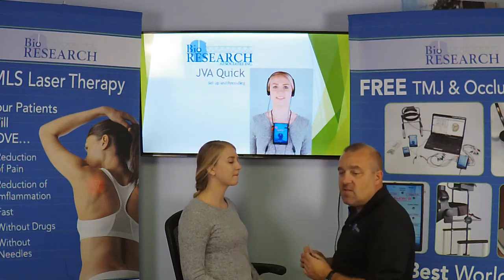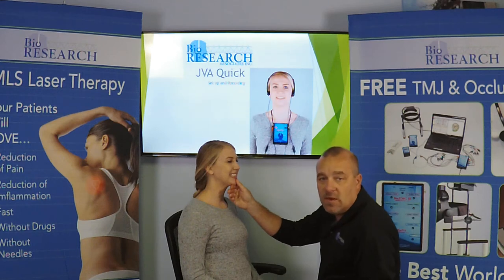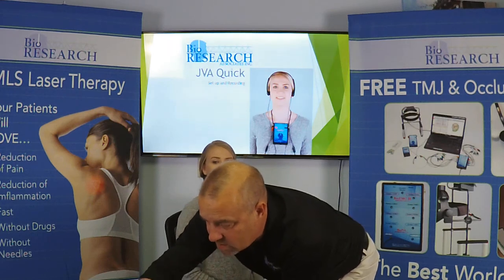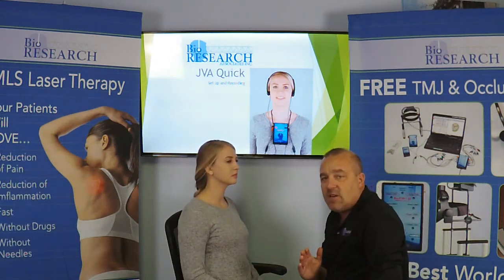Now, when we enter this number, we want to add the overbite or subtract an open bite. So bite, let me see your teeth. Okay, she's got about a 1 millimeter overbite. So I measured incisal edge to incisal edge of 62 plus 1 millimeter of overbite means her jaw is actually moving 63 millimeters. The next question is lateral deflection at maximum opening.